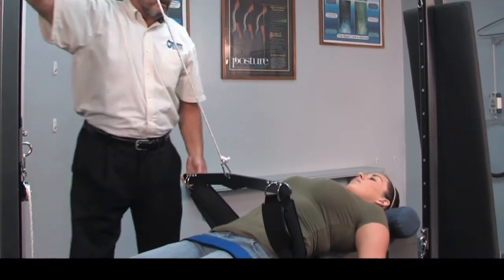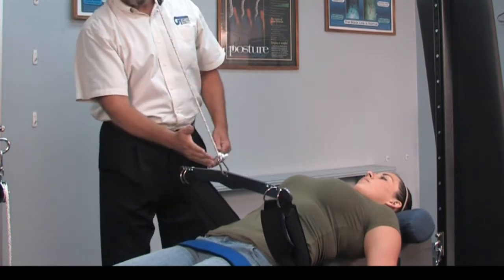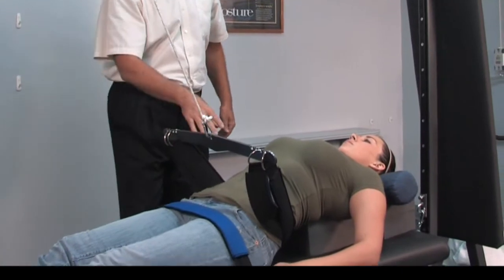With this setup we can vary the angle — we can set for a 30-degree angle, 20-degree, or 10-degree angle, depending on where the most loss of curvature is.